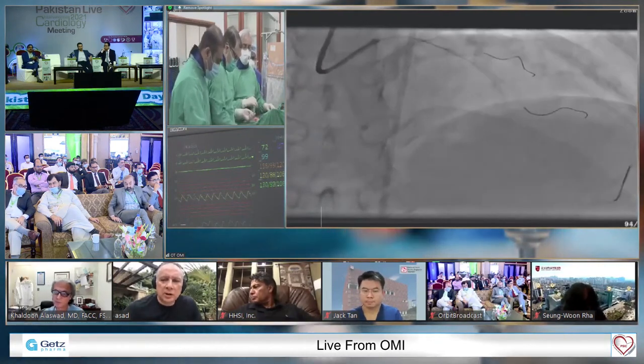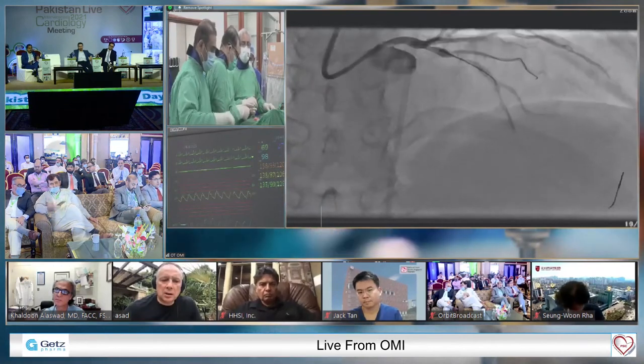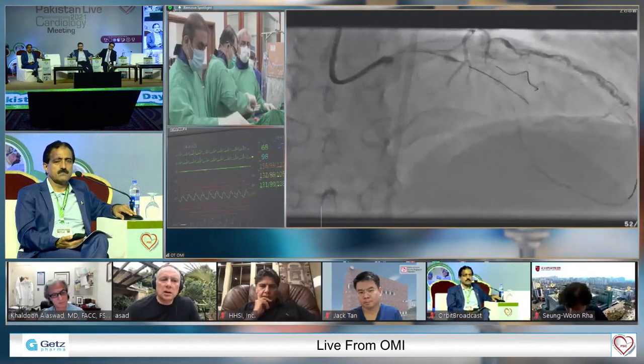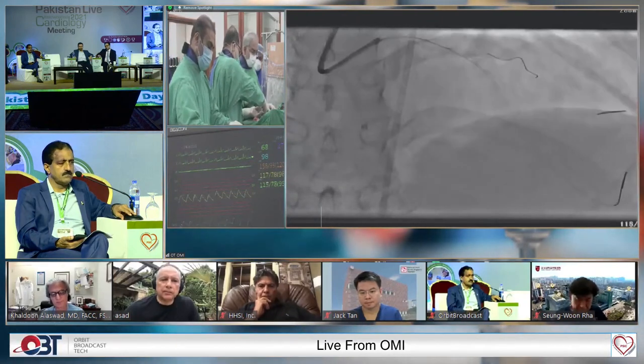Okay, what we say is do the diag and then stent across it to the LAD. NC upsize is 3.5, and we'll see how it goes. And then we're going to finish off that.